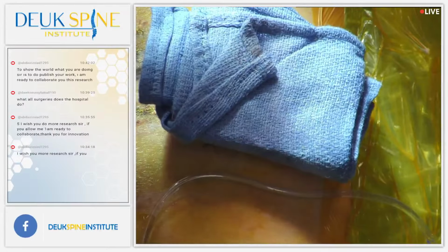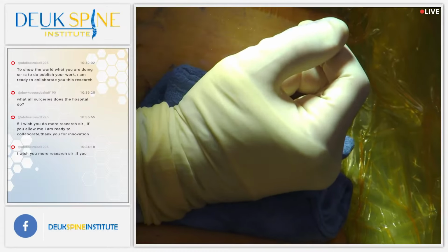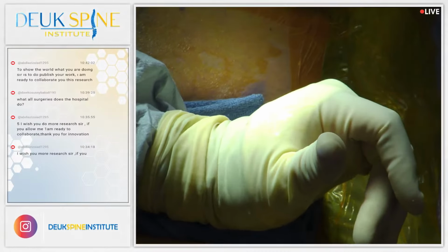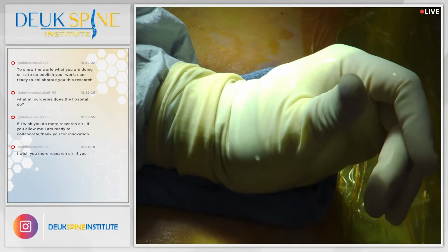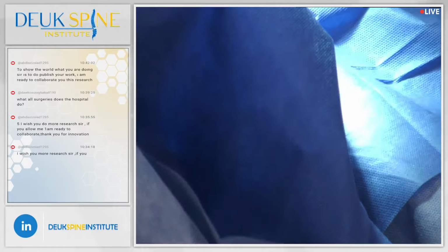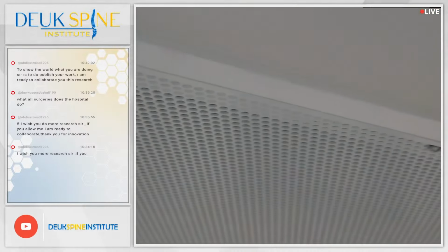We've completed our 2,744. Henry, is that correct? Deuk laser disc repair? 2,744, correct. This is our 2,744 laser endoscopic surgery. 0 surgical complications in 2,744 surgeries.